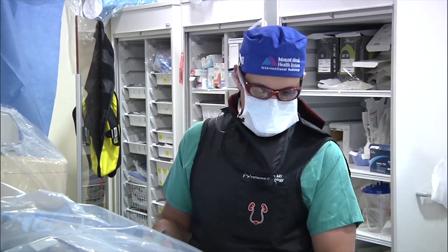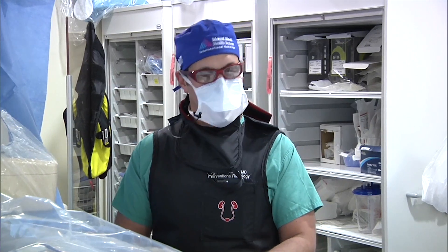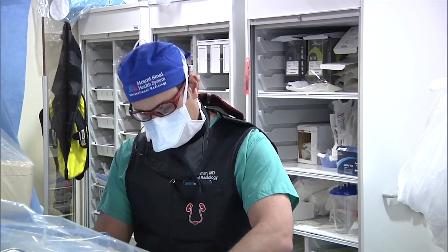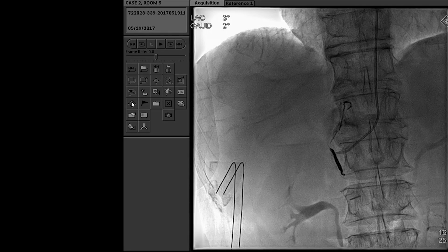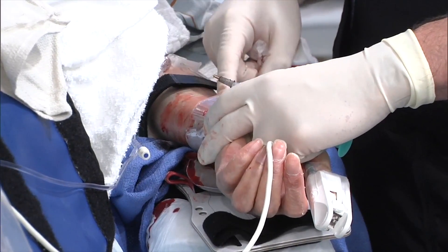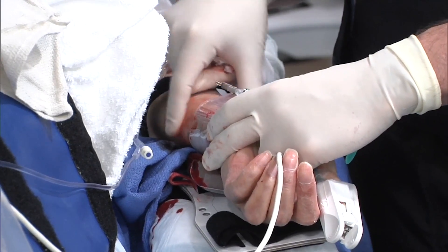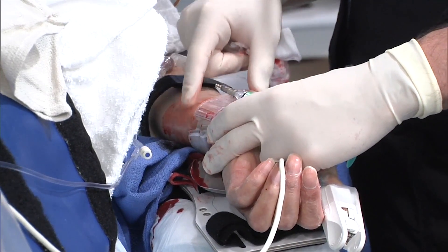If it's an outpatient going home in an hour, we'll take it off in an hour. It really depends on what we're doing. If it's a complex intervention where we give a lot of heparin, we might leave it on for two hours — there really is no limit. I've left it on overnight in a rare scenario where somebody was bleeding after we took it out. The great thing about this is you can see right through it, so I can see that the artery's patent, feel the pulse, and see that there's no bleeding. If there's any bleeding, I'll either put more air into the band, or I'll put a second band a little bit higher with about half the amount of air, and that will tampon whatever is bleeding, either proximal to the puncture site or even a little bit distal. That works really well too.